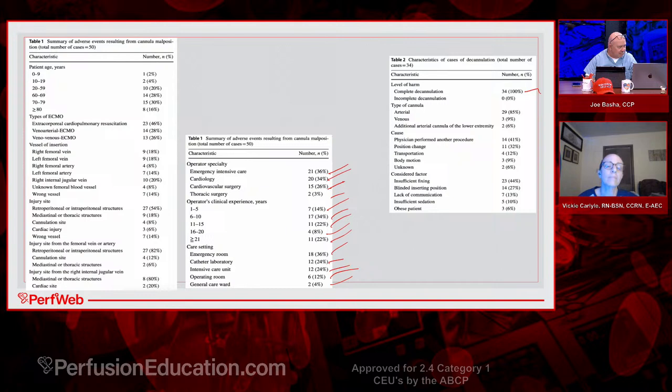I mean, what if the patient was almost ready to wean? No, I said the patient was ECMO dependent. Well, then, yeah, I agree. If the patient is ECMO dependent, yes. If the patient is ready to wean, yes, you would survive that. As long as, let's say you took the arterial out, you'd have to do it before you exsanguinated the patient because the ECMO was still flowing. If you took the venous side out, you've got to stop the air from getting into the arterial system. So there are some issues, and then control the bleeding from the vessel itself. But yes, you could survive it. I would agree with you, could survive. But if you're ECMO dependent, then no, you're not surviving it. Or if you have an Impella in place already that can carry a little bit of the weight for you for a while. Maybe so.